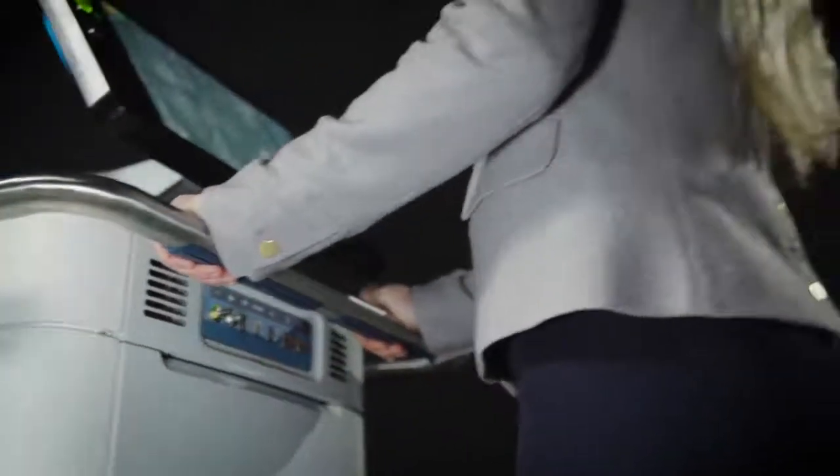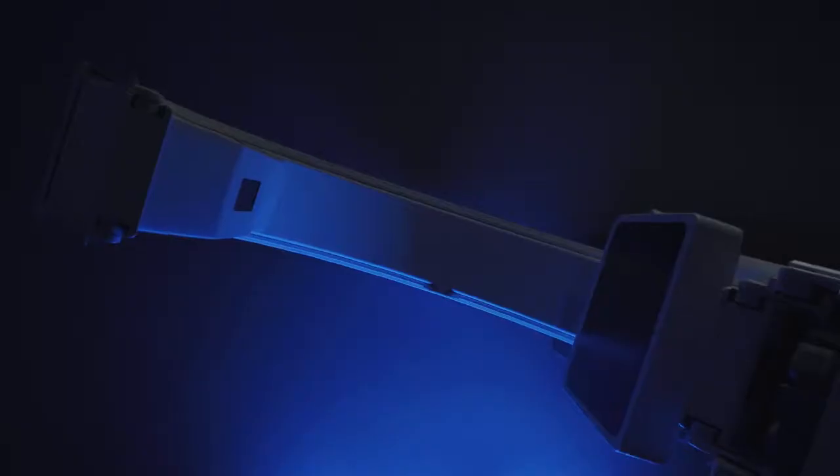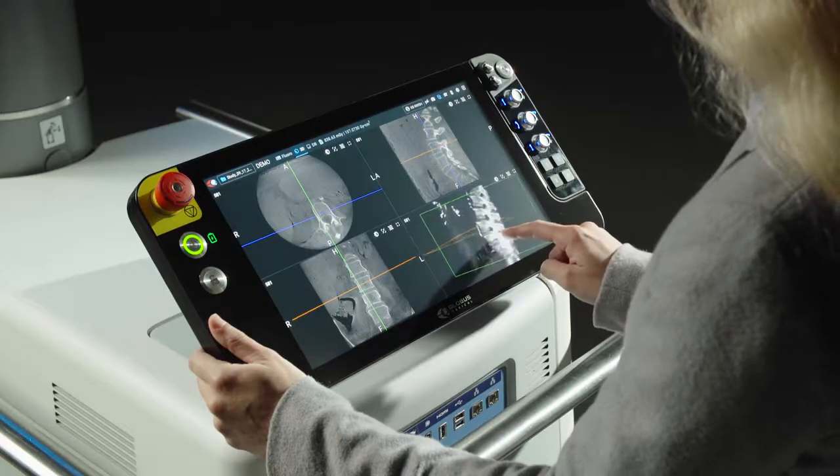Haptic response motion and omnidirectional wheels offer unmatched imaging maneuverability. The large field of view, compact footprint, and elimination of a separate viewing station amplify the system's agility and efficiency.